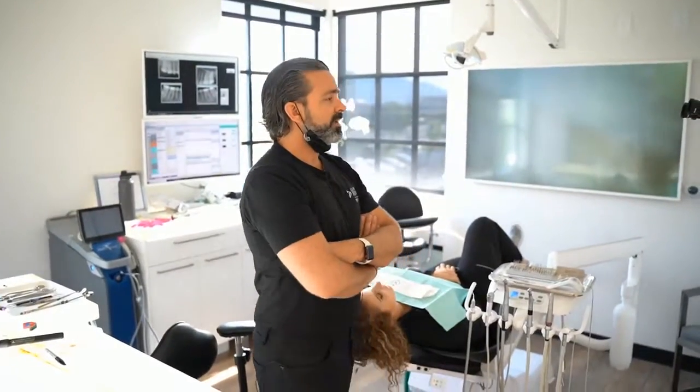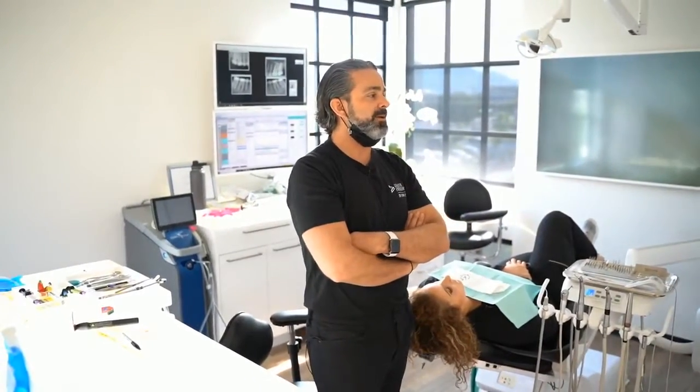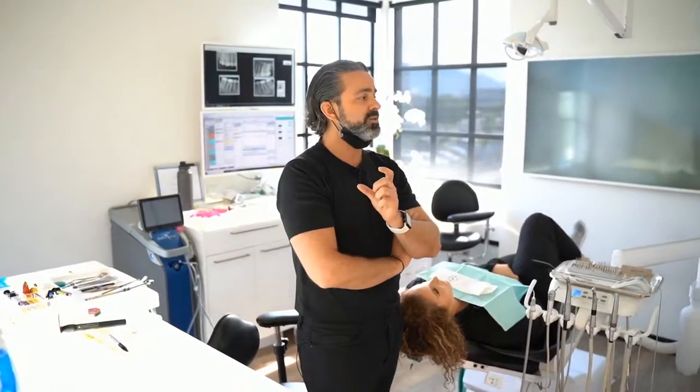How many years have you been using the microscope? Have you been using it the whole time you've been an endodontist? Yeah, so in dental school, when we were in the sim clinic, I bought a pair of loupes as a freshman and went four years of dental school with loupes.